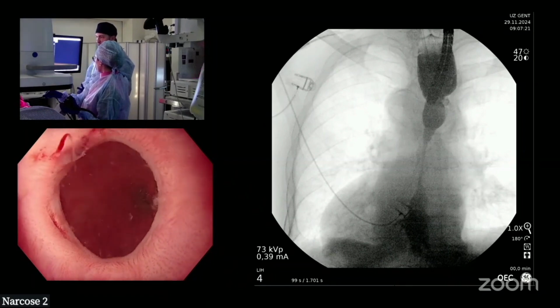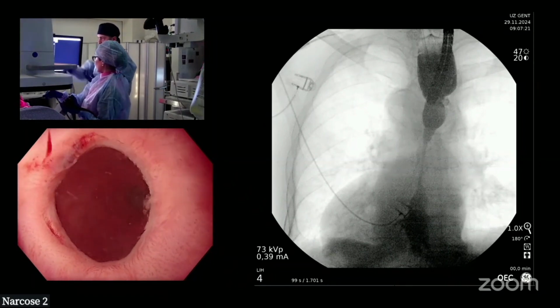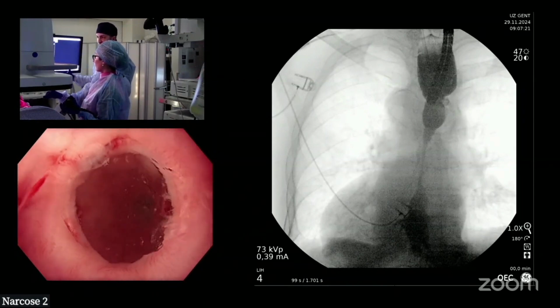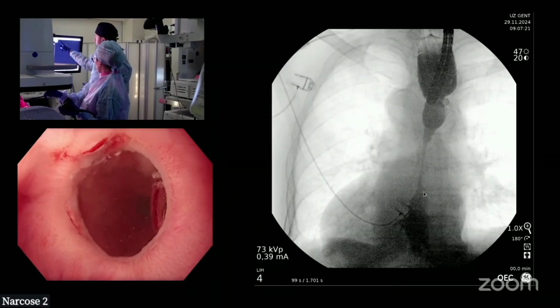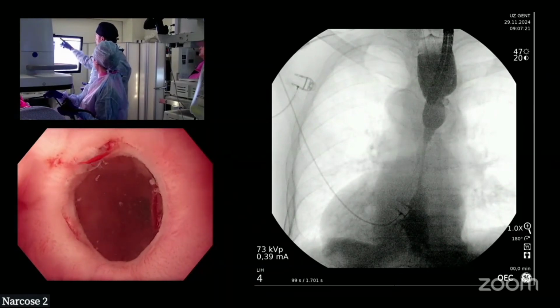So before it got dilated to 12, we saw that on the slide. So that's very important information. The top stenosis is not really relevant at this point, apart from we know that it's quite open. So probably going to need a big dilator. And the second thing is the length of this. So what do you estimate that to be? 3 centimeters? Mm-hmm. 3 centimeters, yeah.